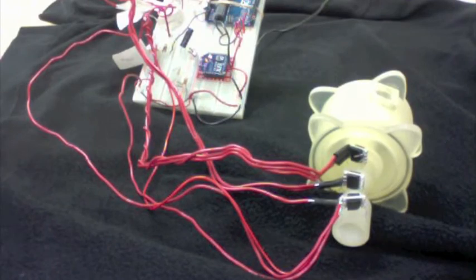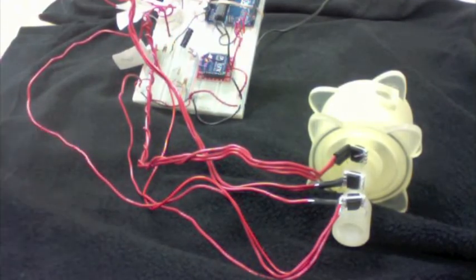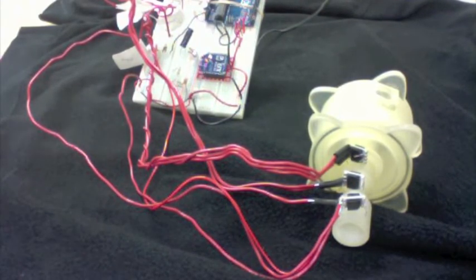Each signal is appended with an identifier in the microcontroller to tell which pressure transducer it came from. At the computer, we read the signal into MATLAB and separate it by which pressure transducer we have. With MATLAB, we may apply a bandpass filter to filter any frequencies below our oscillation frequency. That is, it is necessary to eliminate the power in the signals only associated with breathing.